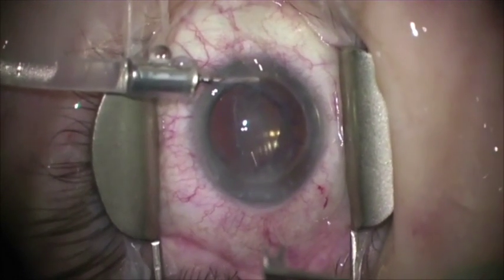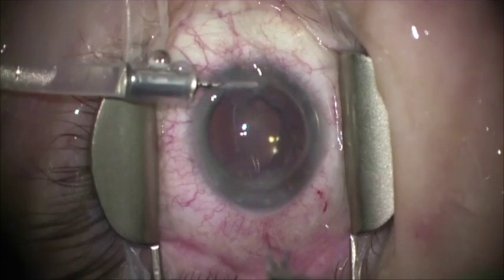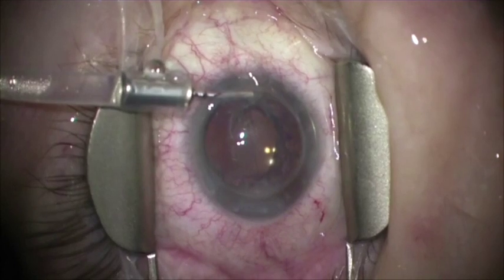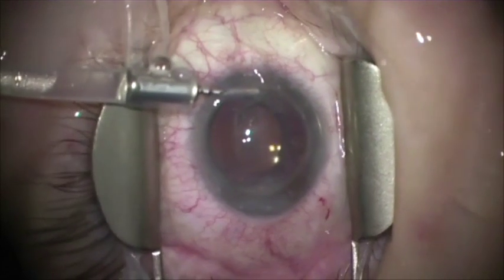And it usually opens up nicely like it did there. I close the temporal incision.